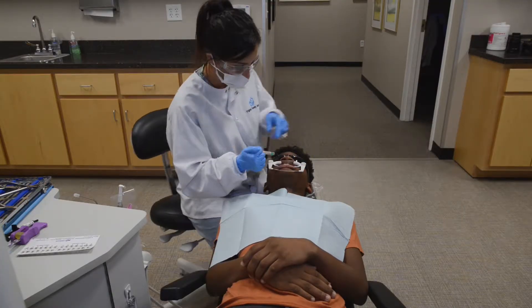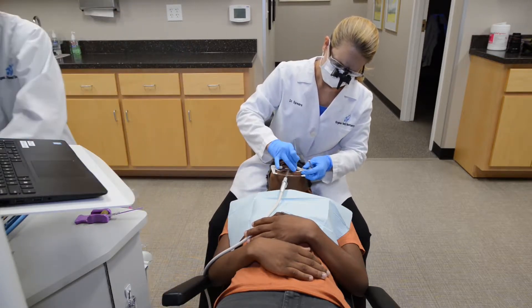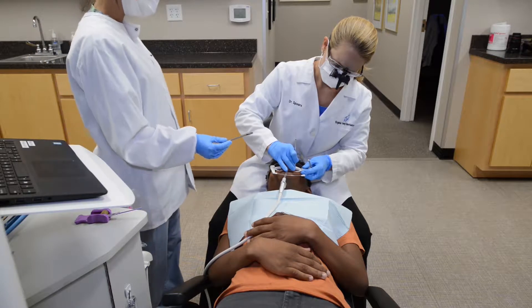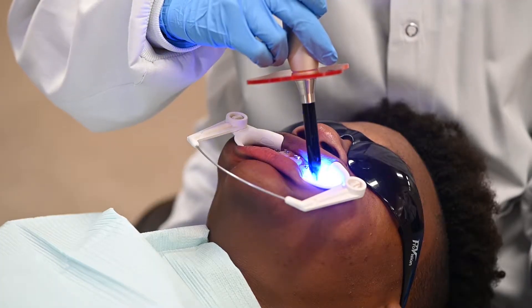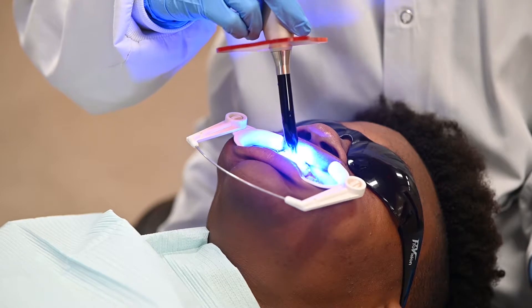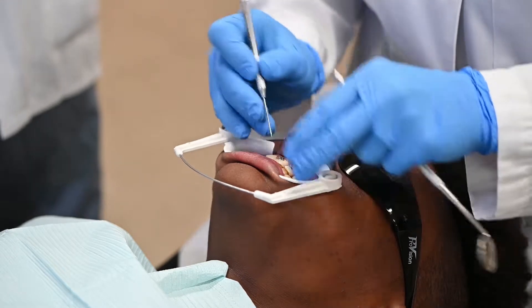We will polish with a slightly abrasive material on the teeth that allows the brackets to be attached. Brackets will be placed either one at a time by hand or all at once using a mold, depending on the orthodontist's preference. This process of placing brackets takes time as the glue has to set using a curing light. We attach one arch at a time. The orthodontist oversees this process to make sure all brackets are placed for optimal tooth movement.